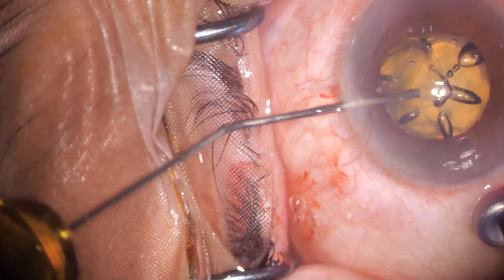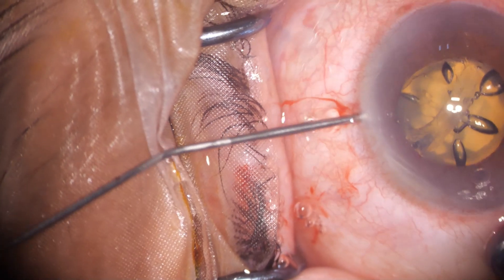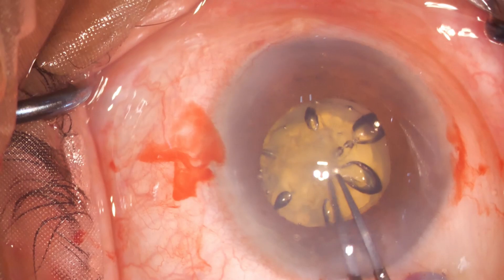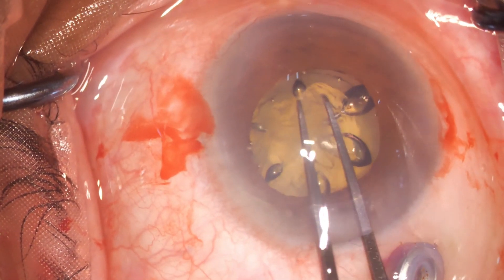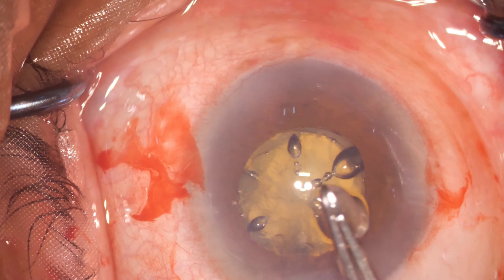Once the vitrectomy starts, the chamber is deepening. You can see movement in the anterior chamber. There was nothing budging before. After this vitrectomy is done, the capsule is removed.